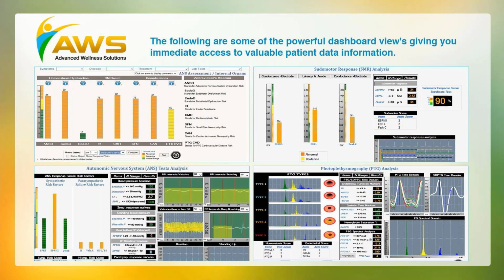As you can see on this one, green is clear up around 800 for ESRNO, and yet this is down at 394. This patient's obviously got neuropathy. ESRL is peripheral distal neuropathy, which is a more complex neuropathy. And both of those contribute to nerve damage.